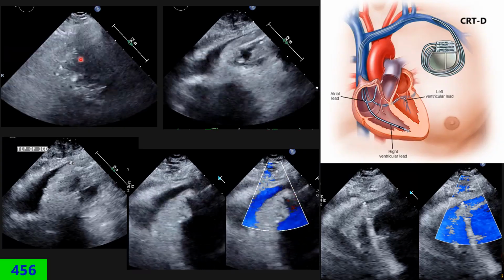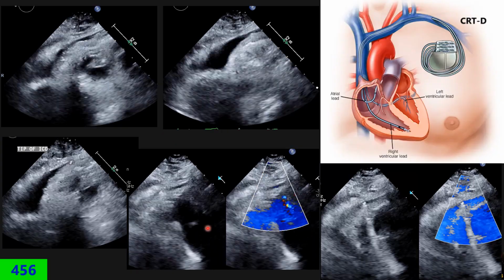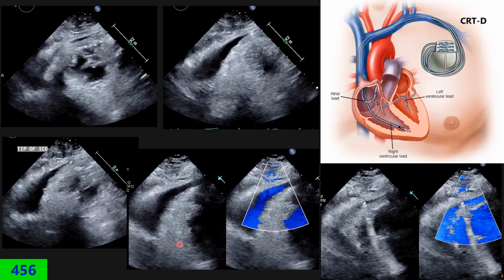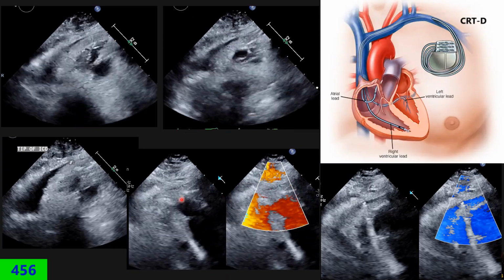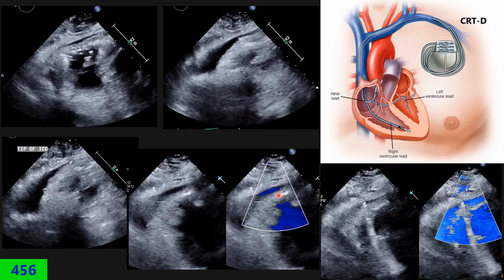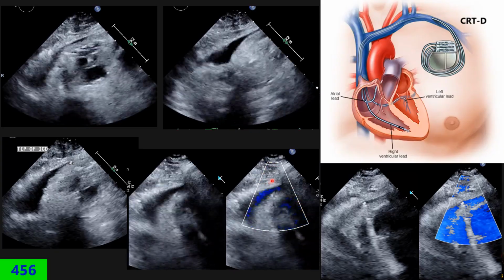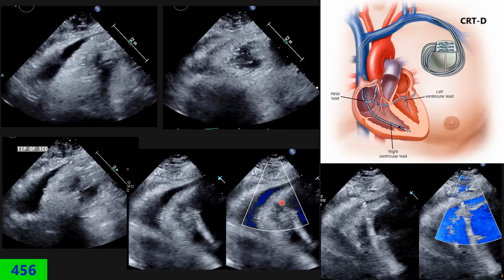And still, we can find a better view with just twisting clockwise or counterclockwise, a little fanning up and down. We can open up the wire completely if we are at the right angle. Then we can see exactly here. You can see it completely perforates the free wall to the outside. We put color on to check that there is not any active bleeding.